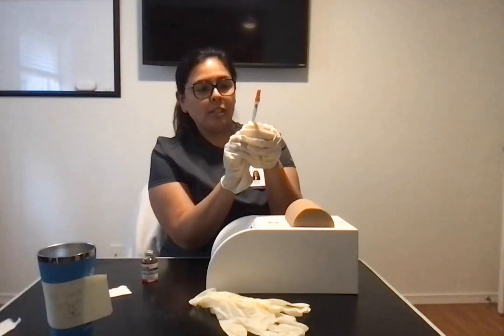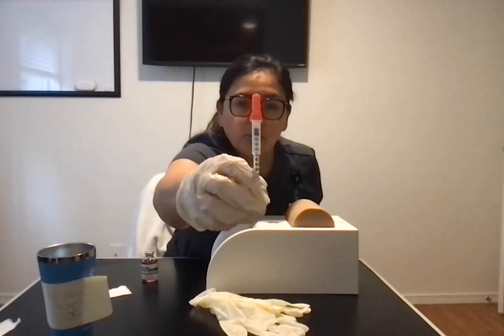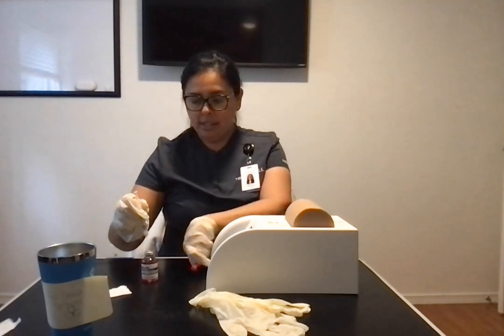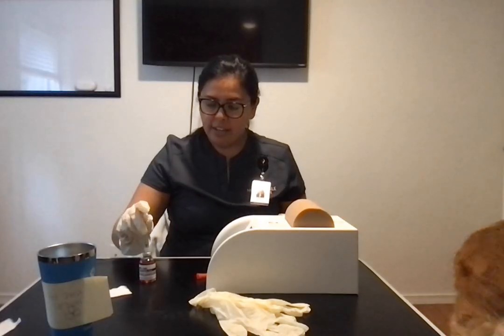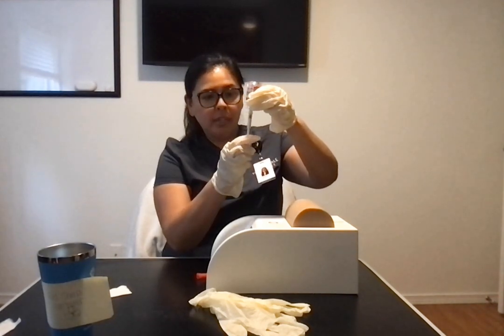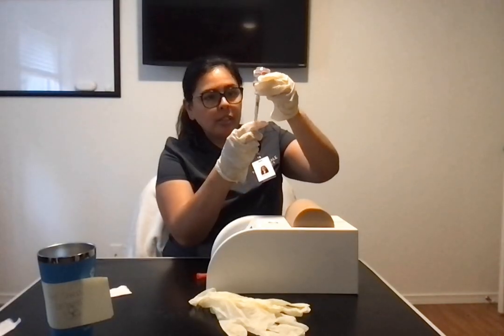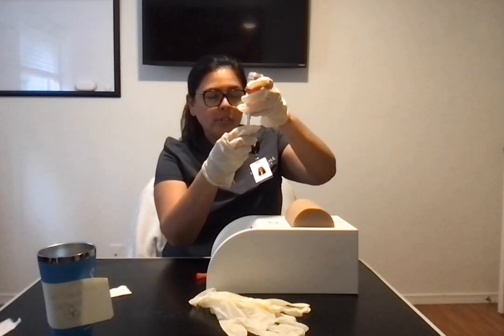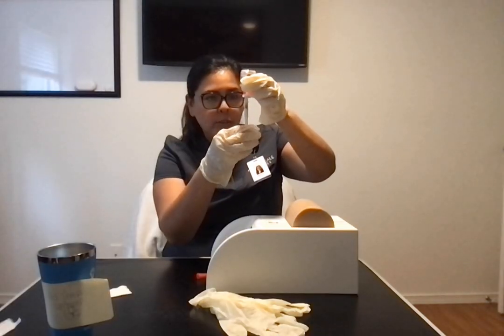Next, I'm going to draw this out to 0.1 mLs. 0.1 mLs. And then I'm going to inject this into the vial. I'm going to push the air in. I'm going to invert it and then draw back slowly to 0.1 mLs, making sure there's no air bubbles. If there were, I would gently tap the syringe just to make sure there are no air bubbles. But this looks like it's going to be okay.